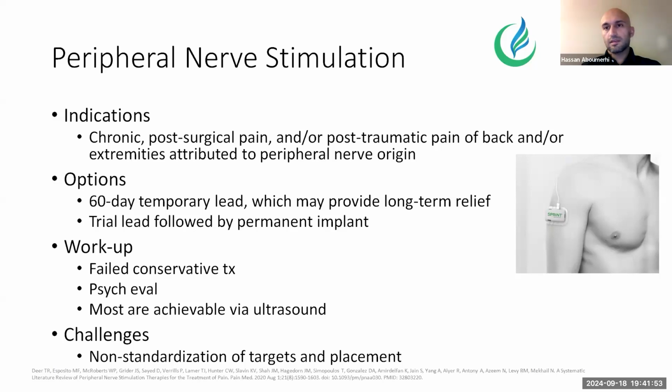But if that's not the case, or the patient's not a candidate, or they absolutely want to avoid surgery at all costs, then that's where these therapies come in. The challenge is the non-standardization of device placement because of the variation in these peripheral pain syndromes.